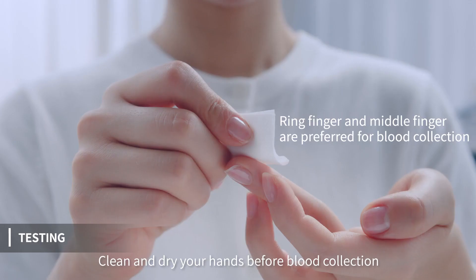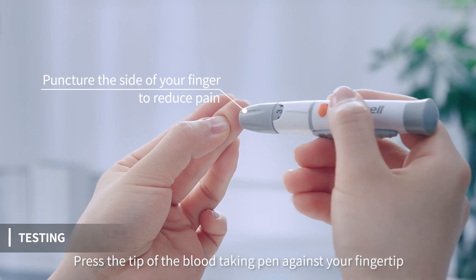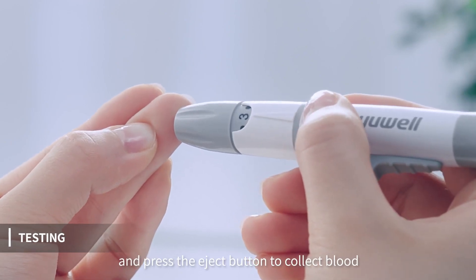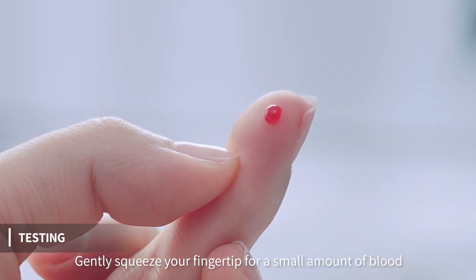Clean and dry your hands before blood collection. Press the tip of the blood-taking pan against your fingertip and press the eject button to collect blood. Gently squeeze your fingertip for a small amount of blood.